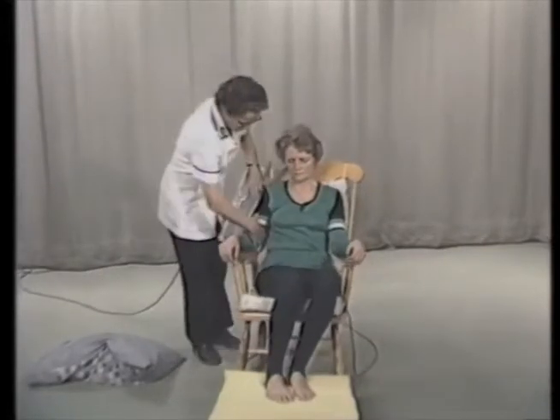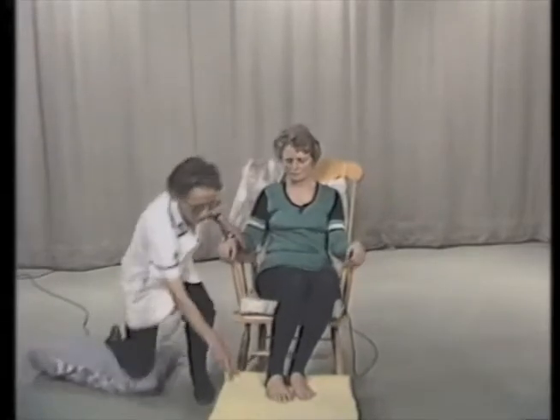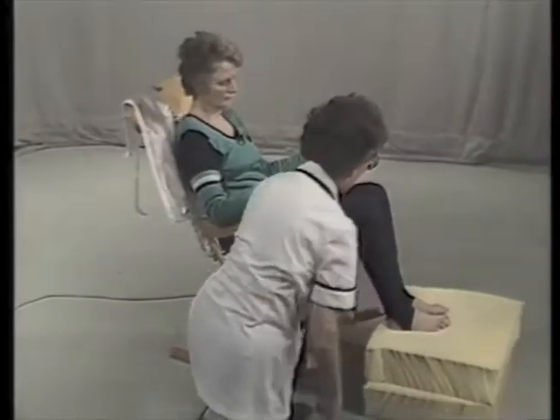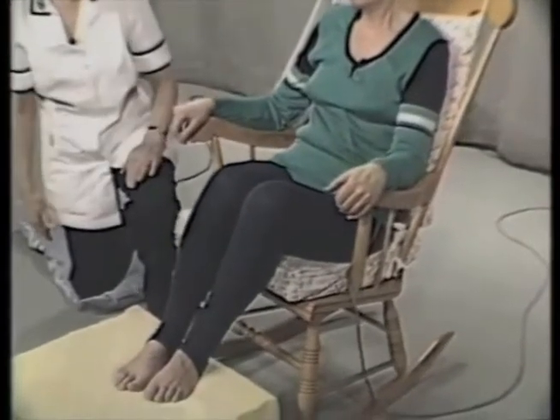The other rocking machine that we use is a rocking chair. The patient sits with her feet on a raised footstool, and the height of the footstool depends on the length of her tibias, because we must make sure she's rocking on heels and not on the forepart of her foot where she brings in the unwanted extension pattern.